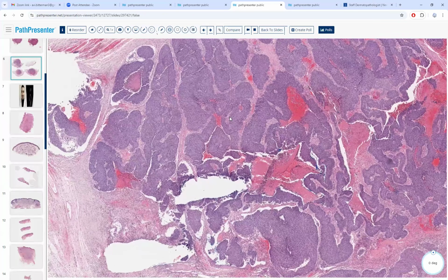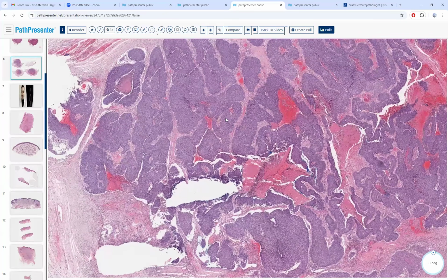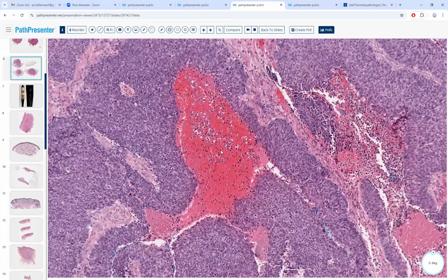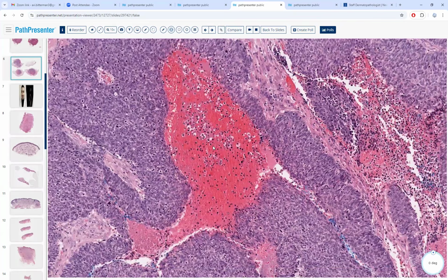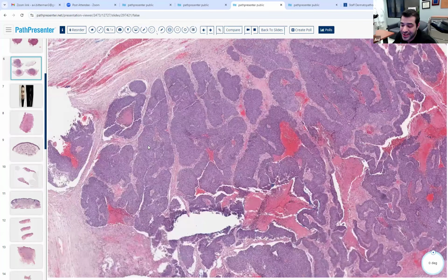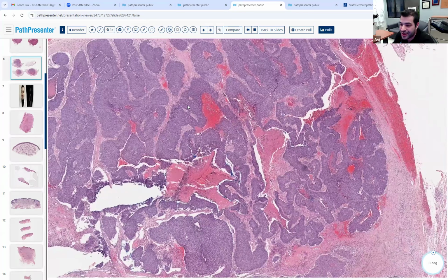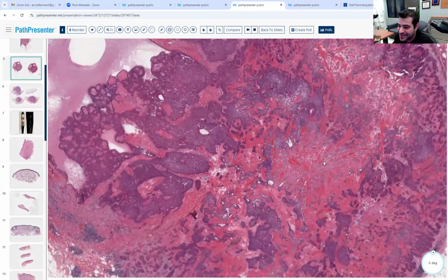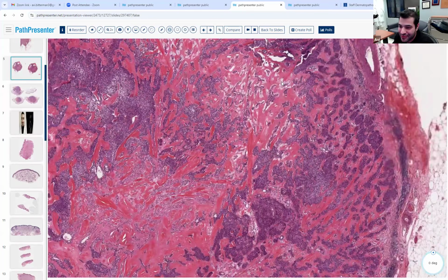It looked like there were areas of hemorrhage at high power. Yeah, so let's see. Is it hemorrhage? Not in this one and the other one, but I could still be wrong. It could have all been just hyalinization or necrosis. Necrosis, rather. Okay, now you can get necrosis in benign things. In nodular hidradenomas, you can get necrosis en masse, so it doesn't necessarily mean malignancy. Oh, Shane's pointing out it's hyalinized stroma for the hidradenoma instead of, I was saying fibrotic stroma. Yeah, that hyalinized stroma over there. This stroma is really good for hidradenoma.